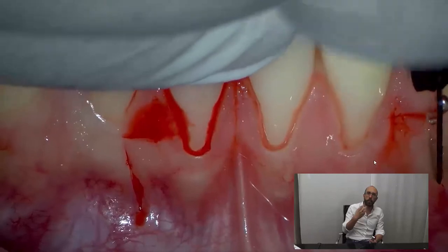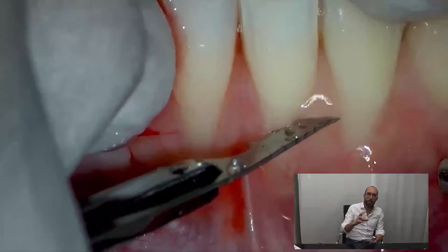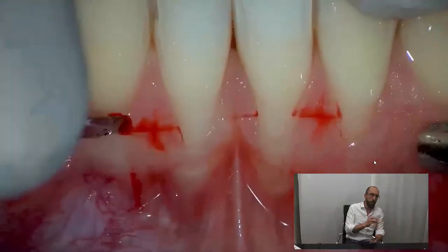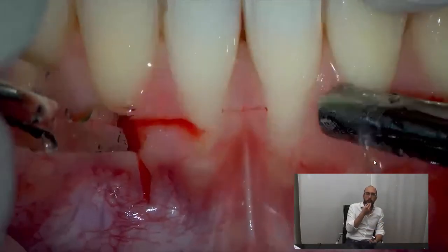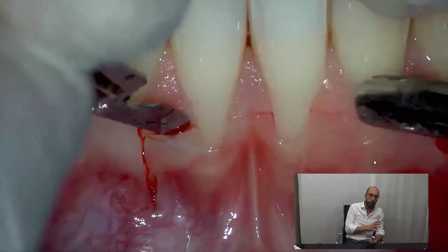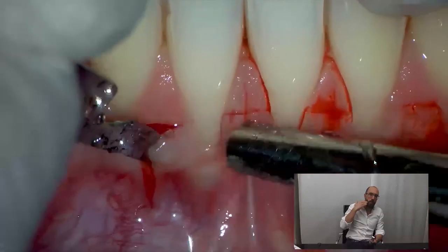This is definitely the most difficult mucogingival surgery you can perform in the mouth of your patient. Root coverage with a coronally advanced flap in the anterior mandible is a very tough surgery — don't do it as your first surgery.